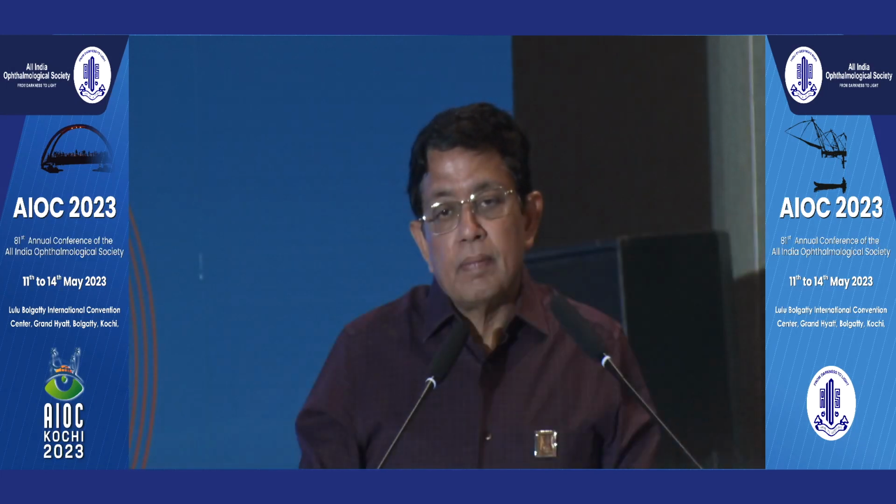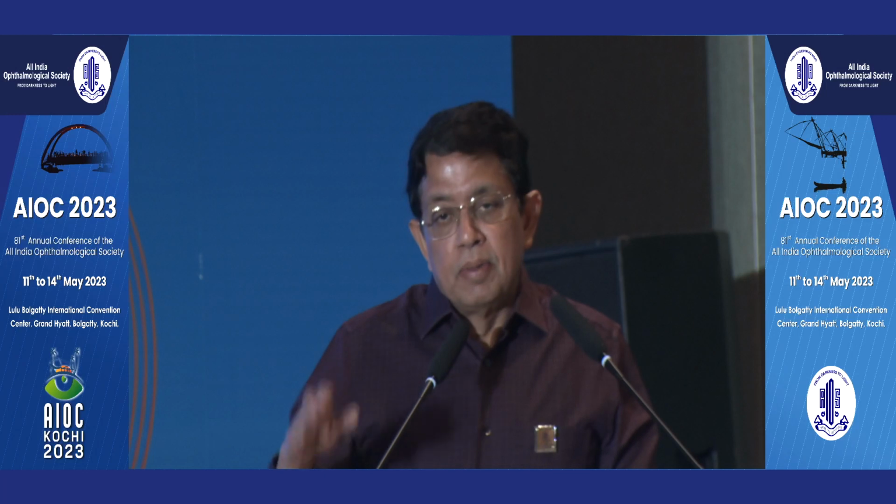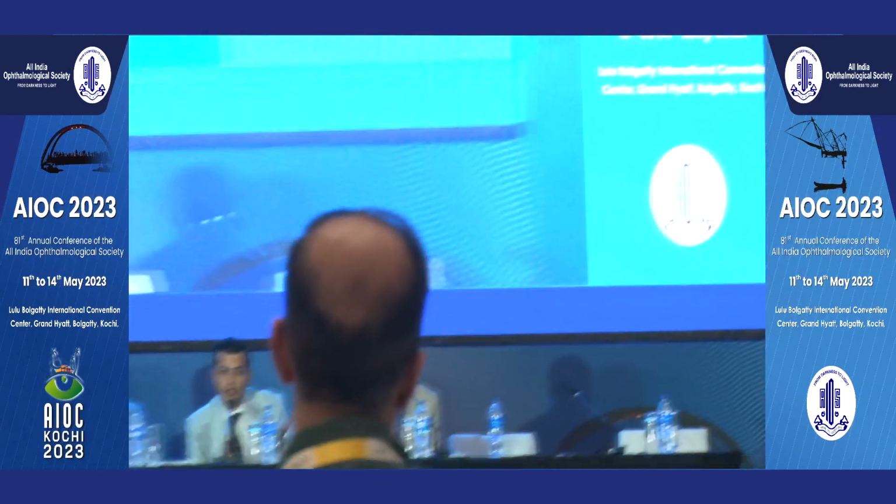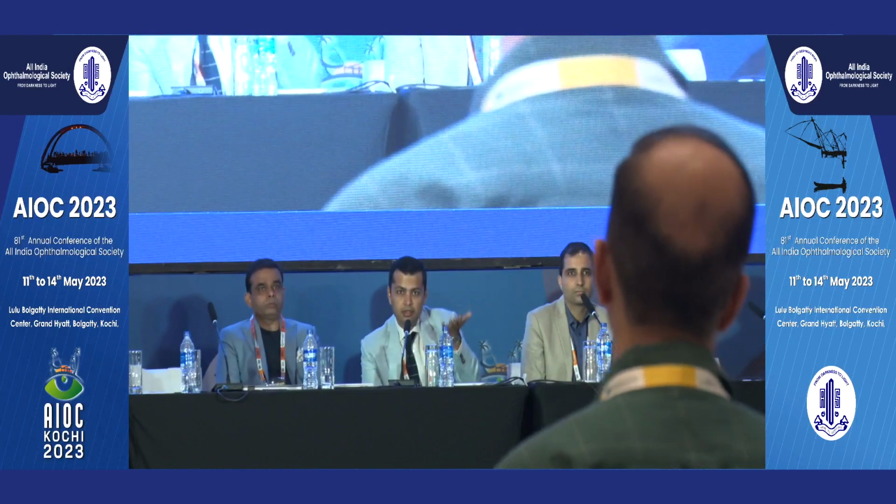Then IQ also we have to rotate. Absolutely. With IQ you will have to; it's only the Lisa toric maybe which you can leave like that because it's a plate haptic lens. Also, the lenses have posterior angulation. So that lens is actually like this. If you tilt it, you might also have a refractive surprise because the lens will sit more towards the cornea.